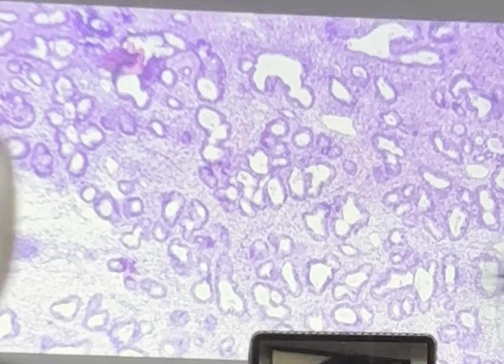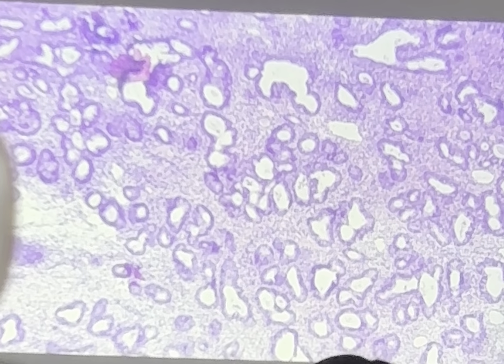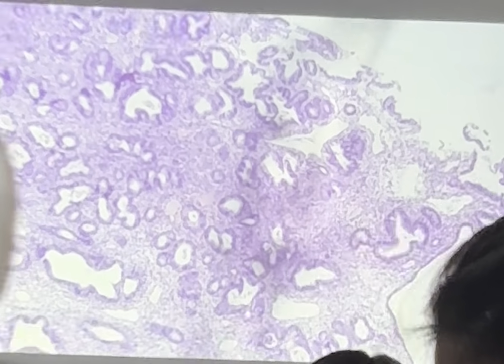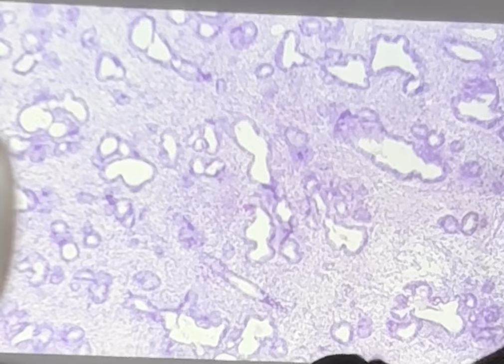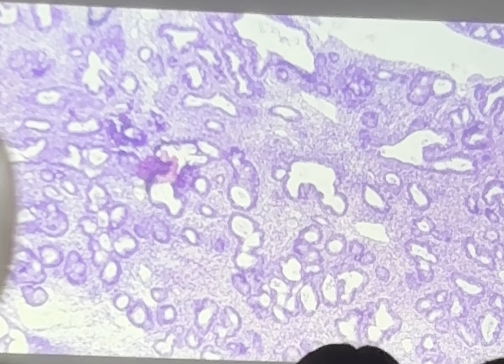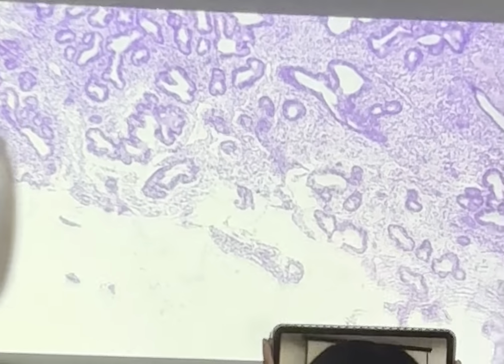This is another endometrium. This is a better one than the old one. Look at these glands. Some of them are very cystically dilated, right? And then are they in a nice, beautiful arrangement, or are they just kind of blah? They're just a little bit everywhere, right? In no particular direction. And there's more. They're very close together, in different directions. This is your diagnosis: endometrial hyperplasia.